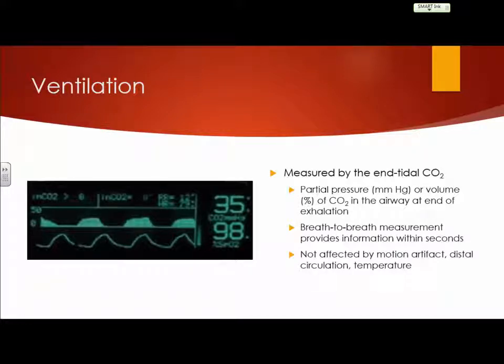The big issue with your CO2 monitoring, and because they had all the children's expo stuff set up, I couldn't find the ETCO2 monitoring attachment. But if you can imagine just for a minute that we've got the end that you put on the ETCO2 on this, all right, a couple of issues you may run into. One of them, this is a pretty flimsy tube, right? What happens, in some patients, when you intubate them?